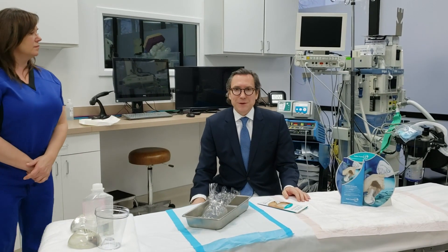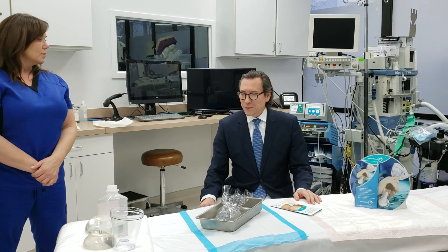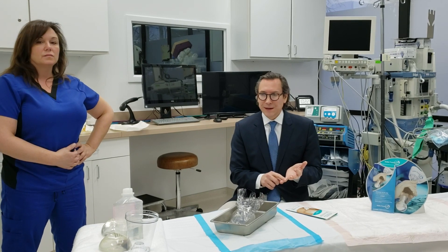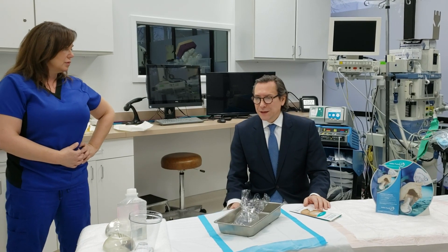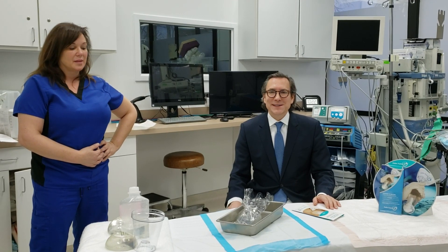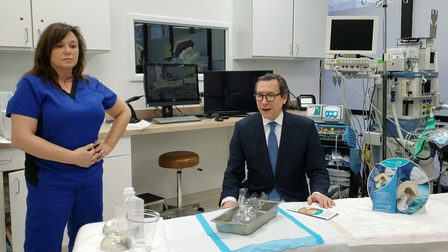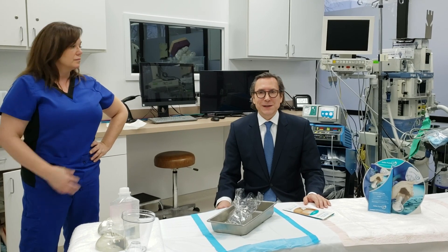I currently believe that the opportunity to minimize complications happens at the time of the operation. If you can do everything in your control to make sure that there is limited to no contact of the implant to the skin, and there's no contact of hands, gloves, or blood to the implant, you will minimize your complications. Therefore, we use the Keller Funnel on a regular basis, and it is part of our safety program to keep breast augmentations as simple, comfortable, and non-complicated for the patient as the years go on.